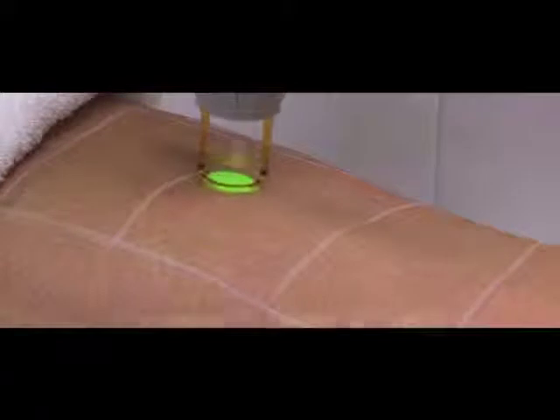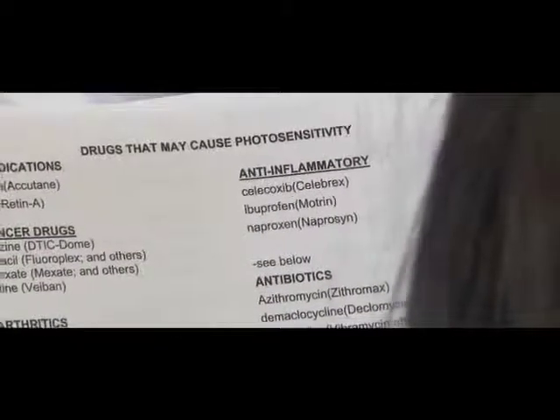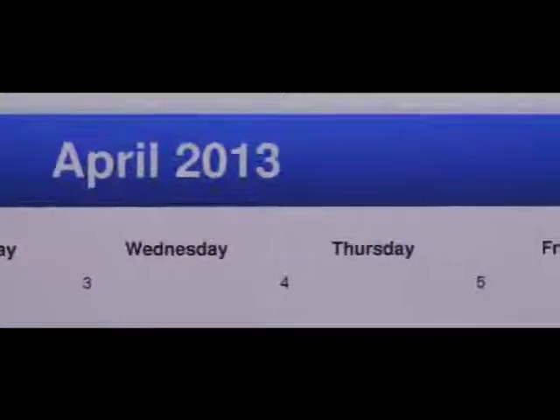The next step towards beginning the treatment should be the test spot. Some practitioners prefer to carry these out days prior to beginning the full treatment session. This is especially recommended in patients with darker skin types or under special circumstances such as the use of potentially photosensitizing medication. In these cases, it is best to wait 48 to 72 hours before assessing the skin's response.